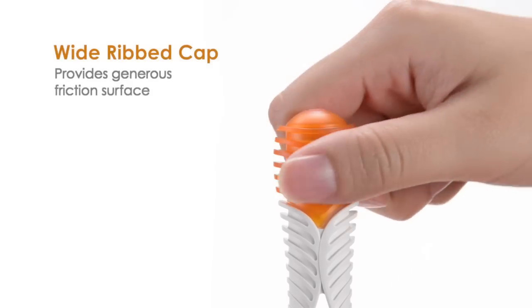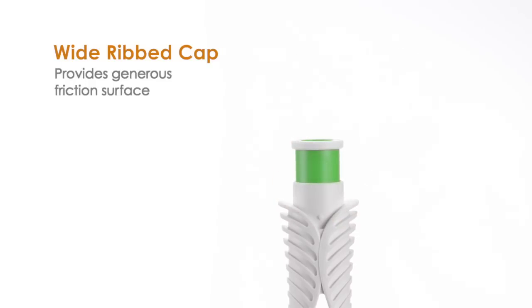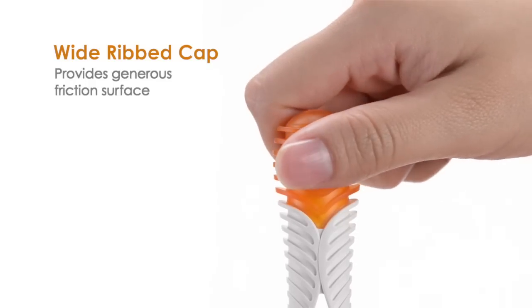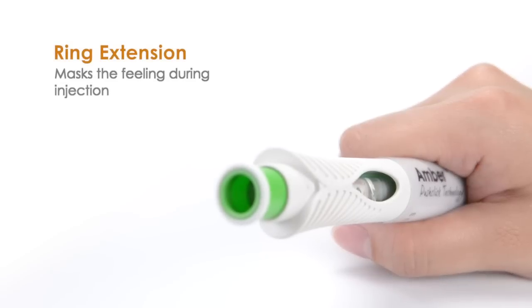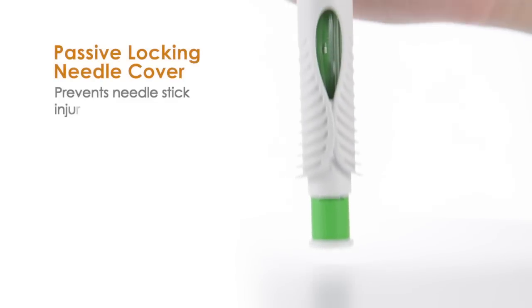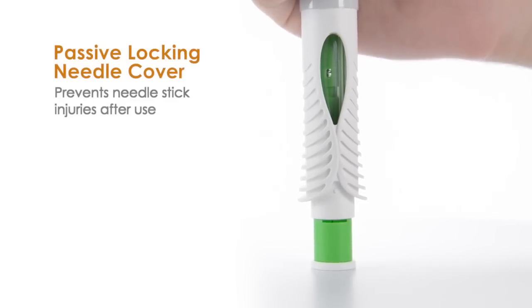The wide ribbed cap provides a generous friction surface to improve the cap removal experience and can be twisted off. A ring extension masks the feeling of the injection, and a passive locking needle cover prevents needle stick injuries after use.